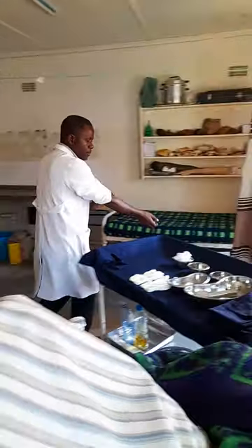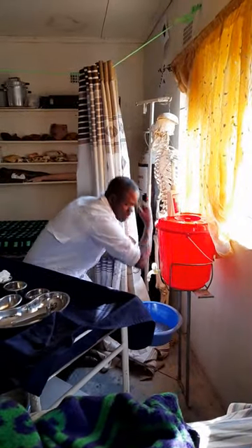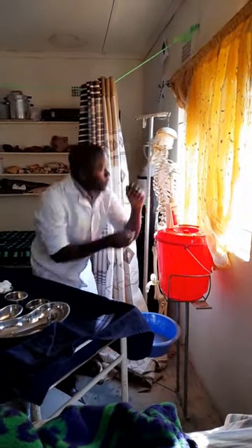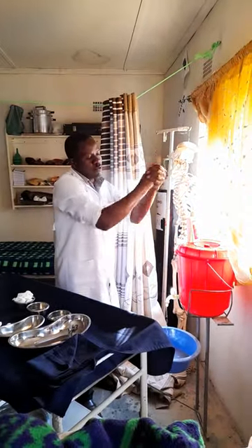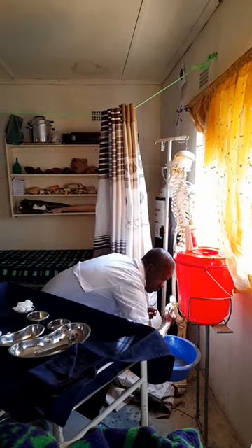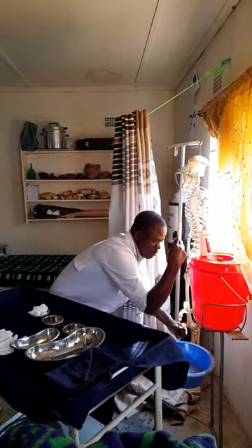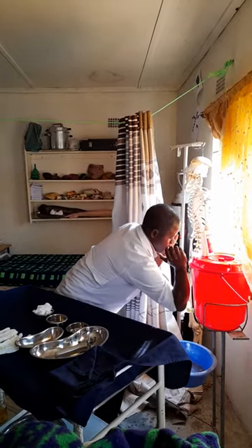You can now scrub. Scrubbing as usual: go one, then two, then come to this side and do that, then lock. Scrub up to the elbow on both sides.